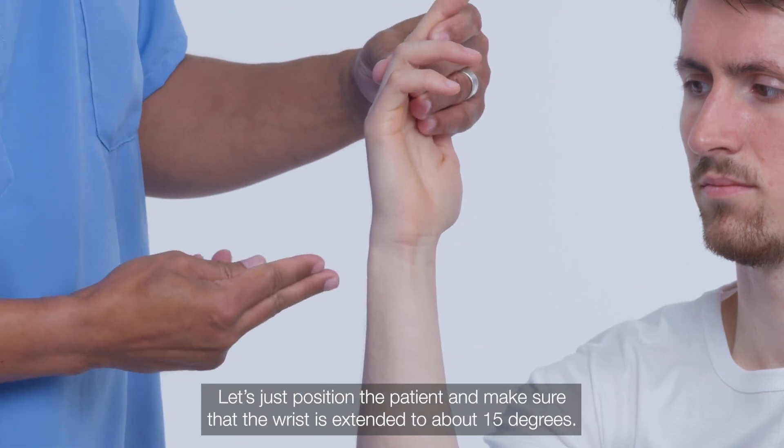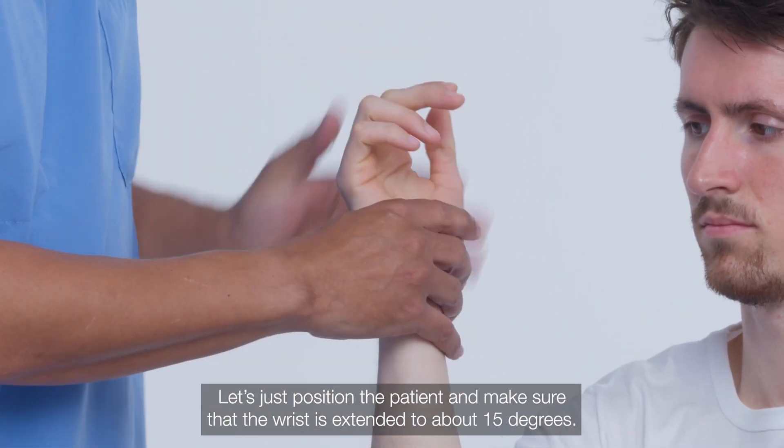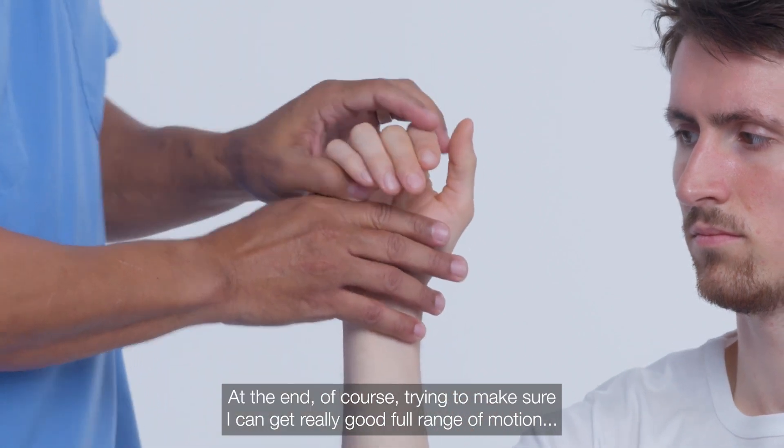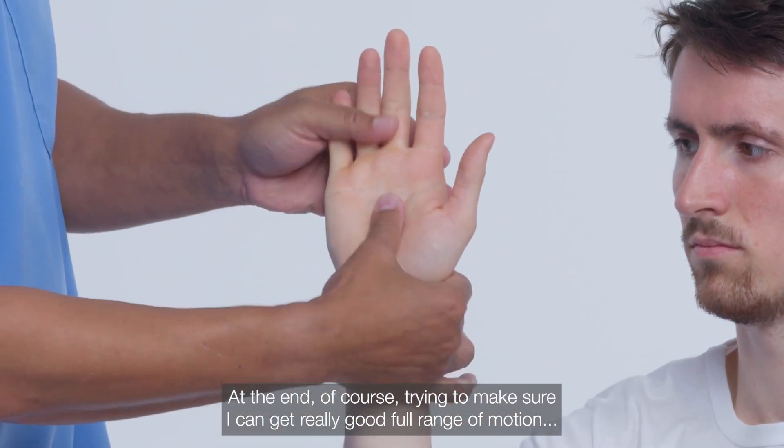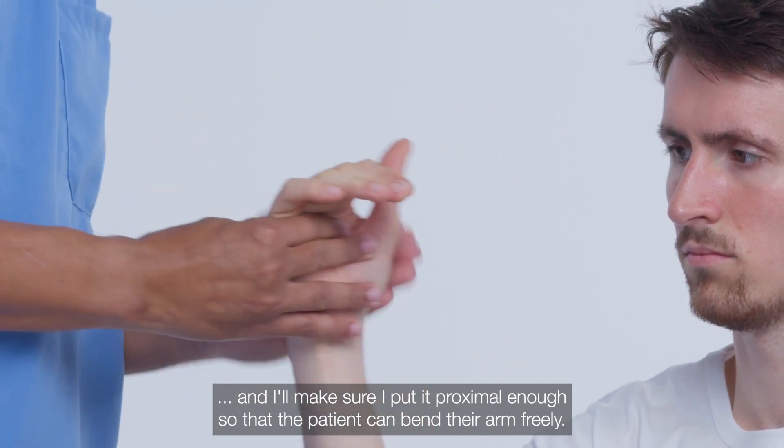Let's position the patient and make sure that the wrist is extended to about 15 degrees. I'm trying to ensure really good full range of motion, and I'll make sure I put it proximal enough so that the patient can bend their arm freely.